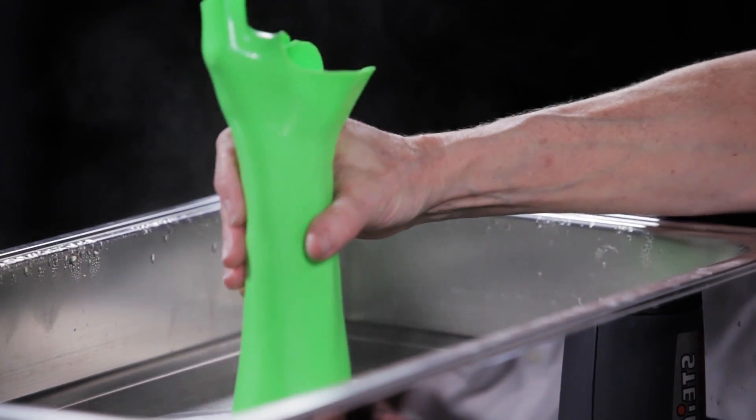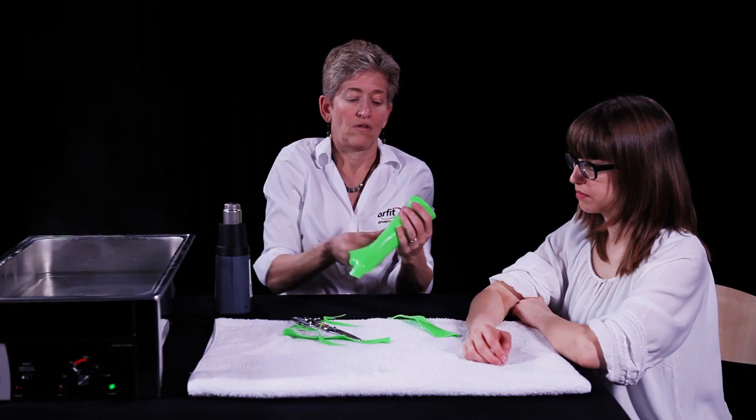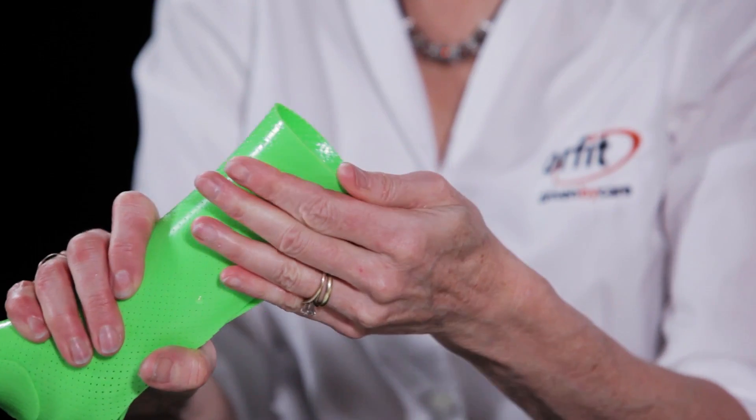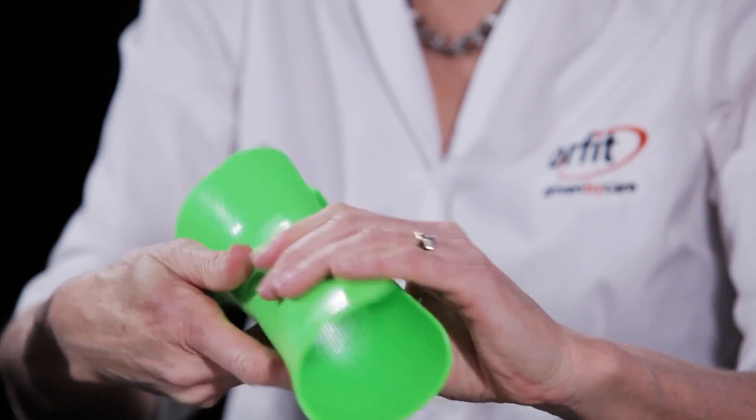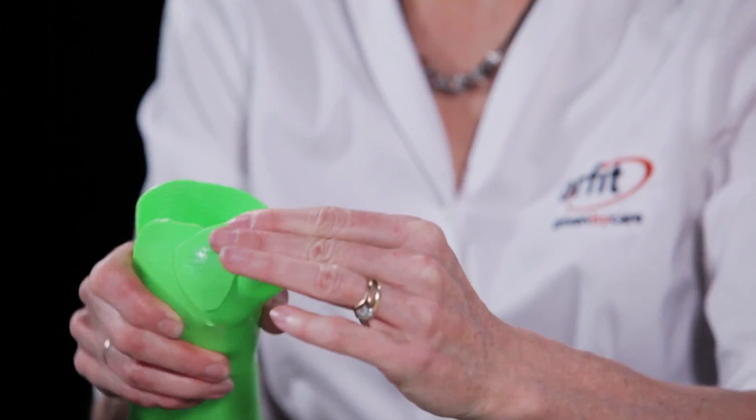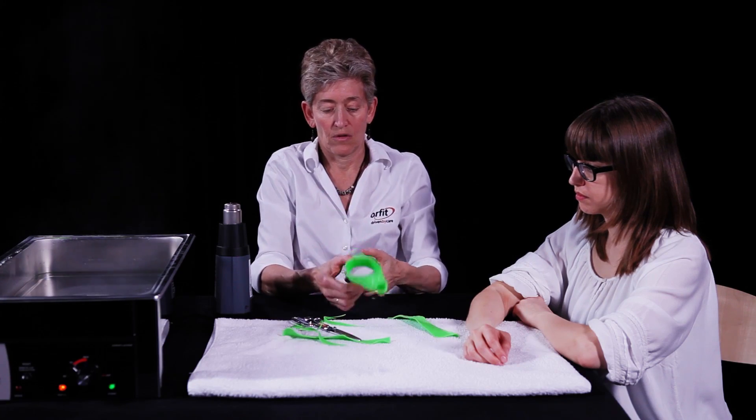Briefly heat the proximal edge of the orthosis and slightly flare away this edge with the fingers. Smooth the edges of the thumb with the fingers or roll it back and pinch for a neat edge.